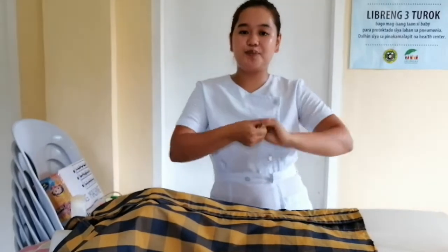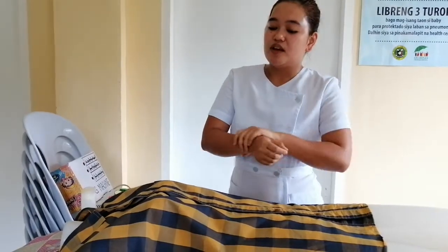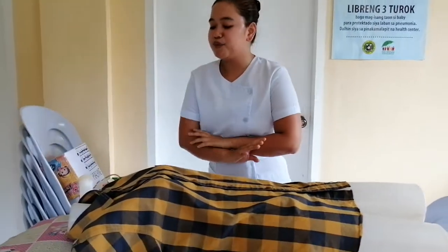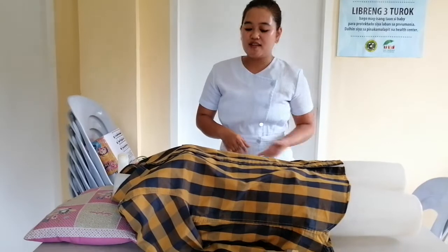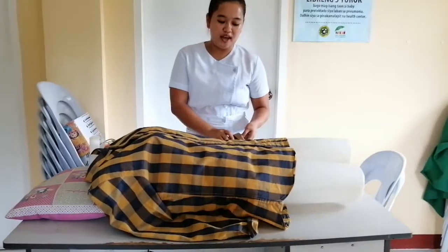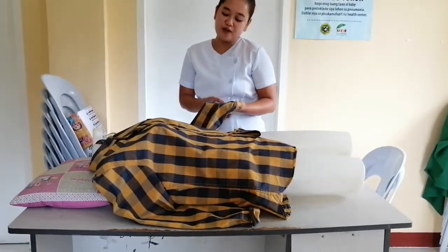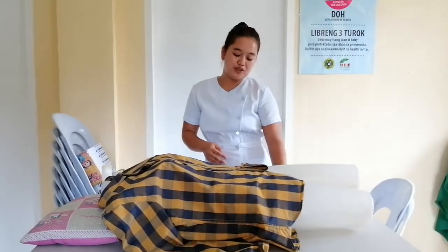This is to prohibit the spread of the microorganisms. And then, you're now going to identify the client's identity. Ma'am, ano pong pangalan nyo? If you're not contented with the client's response to you, you may continue to check on the client's identification bracelet. So assume that I'm holding the client's identification bracelet. So to verify the client's identity, oh yes, the client is correct. Then proceed on the procedures.